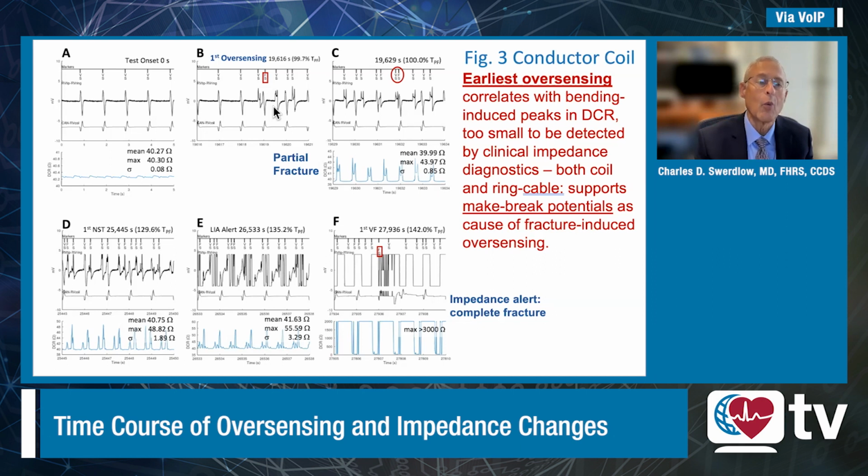And so while these are not necessarily specific, they should at least raise a suspicion for enhanced monitoring so that we can keep an eye on that lead for progression of any changes that we can be certain are due to lead fracture. And by doing that, we may improve our ability to identify electrogram characteristics that distinguish lead fracture. So I think those are our key clinical findings, or key clinical implications, sorry.